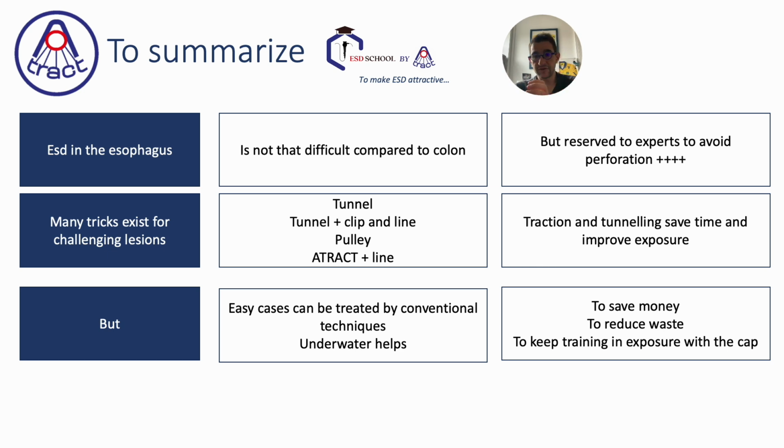So keep easy cases with easy means and conventional strategy to stay very trained for more difficult parts, in order to do your incision very quickly and easily before putting traction for difficult cases.